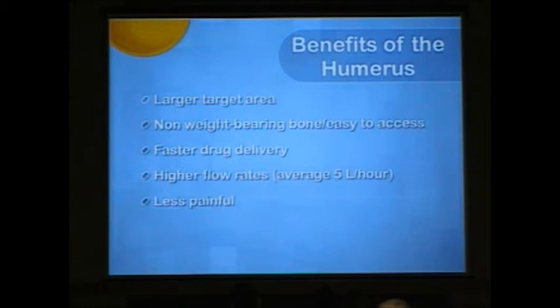The other benefit is because it's a larger bone and the marrow space is bigger, the pain of the insertion and the flush and infusion is much less than the tibia. In a conscious patient, you should prefer the humerus over the tibia. Much less painful in the humerus than the tibia. And there's no risk of compartment syndrome. One of the major complications of intraosseous access using any device is infiltration of the fluids into the soft tissues, which may lead to compartment syndrome. There is no risk of compartment syndrome in the arm, so the proximal humerus has that advantage.